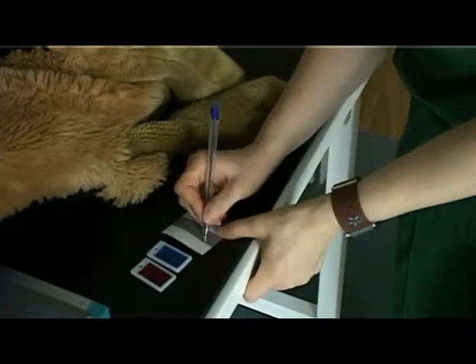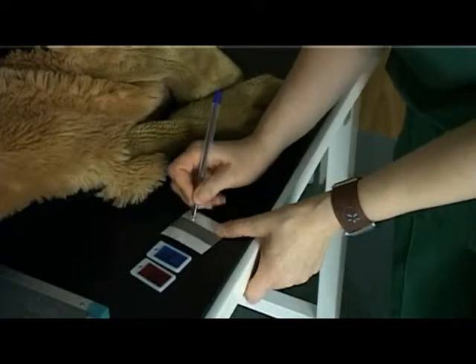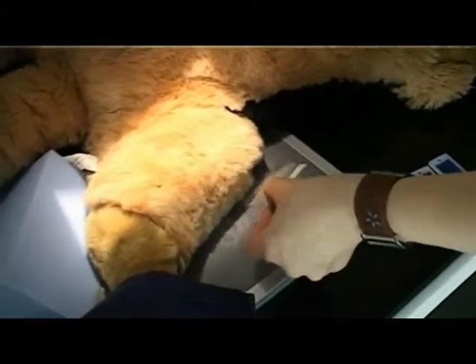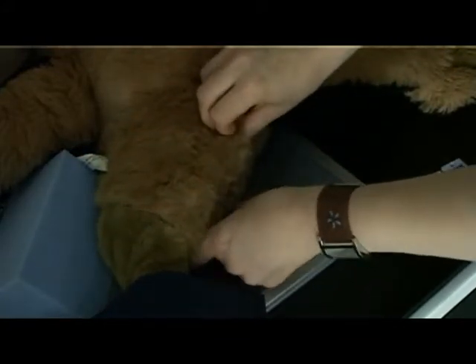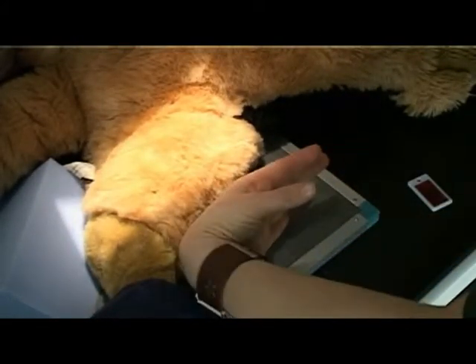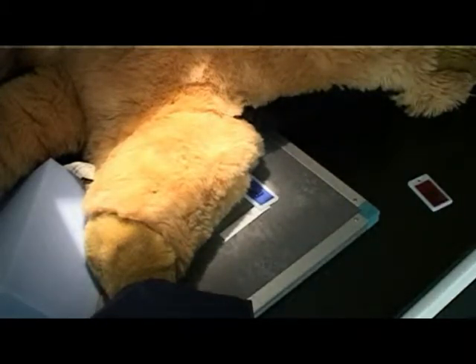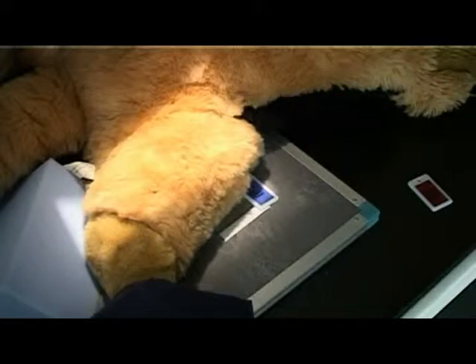Label with the patient identification and date and place this within the primary beam. Place the left marker correctly within the primary beam. You have now correctly positioned the patient for a medial lateral radiograph of the left tibia and fibula, including all the necessary equipment.